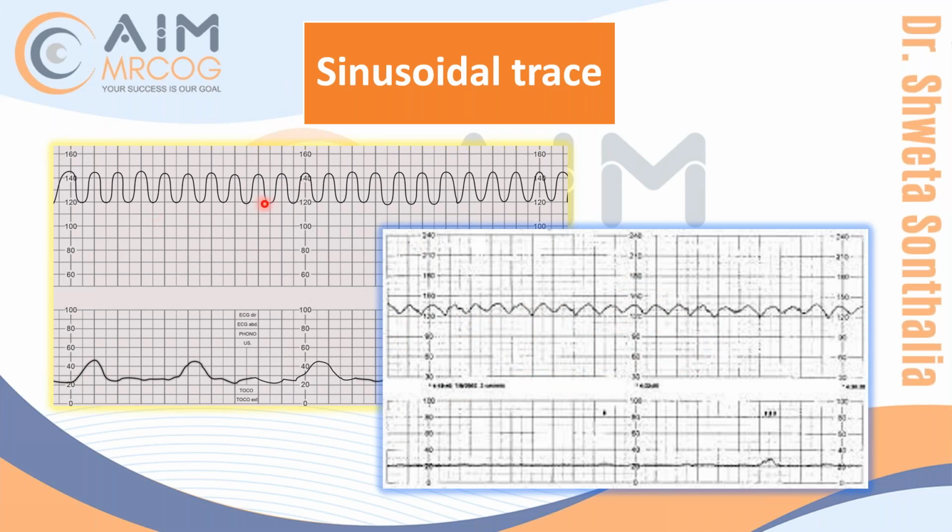And this is not variability. This is sine wave pattern, which is very detrimental for the baby.